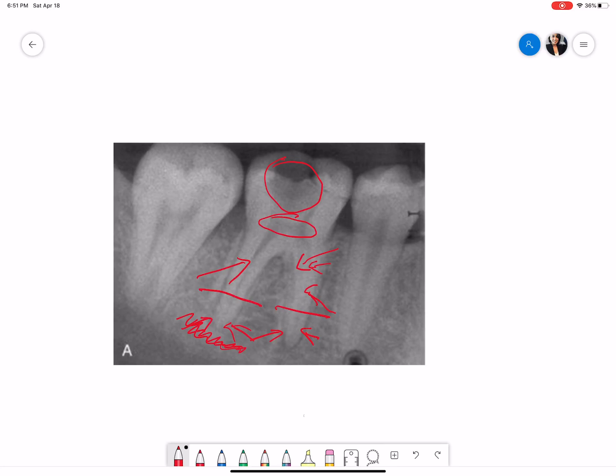Now coming to the interdental alveolar bone between tooth number 29 and 30, the levels appear to be normal. Between tooth number 30 and 31, there is some amount of bone loss and this bone loss appears to be in an angular fashion.